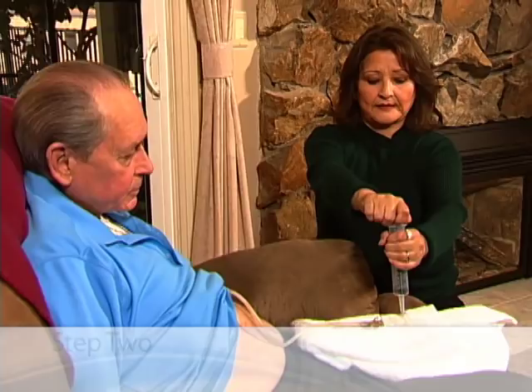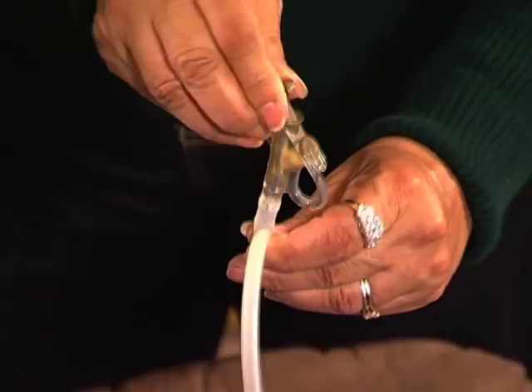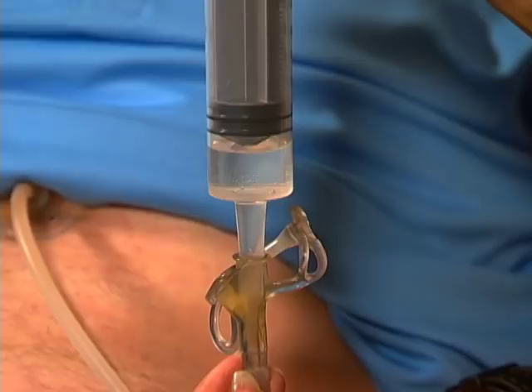Step 2. Pull the plunger out of the syringe. Pinch, clamp, or fold over the feeding tube to prevent any stomach fluid from spilling out. Open the end of the feeding tube port. Put the syringe tip in the feeding tube port. Unfold or unclamp the feeding tube. To help prevent clogging, you should flush your tube with the desired amount of water before and after each feeding.